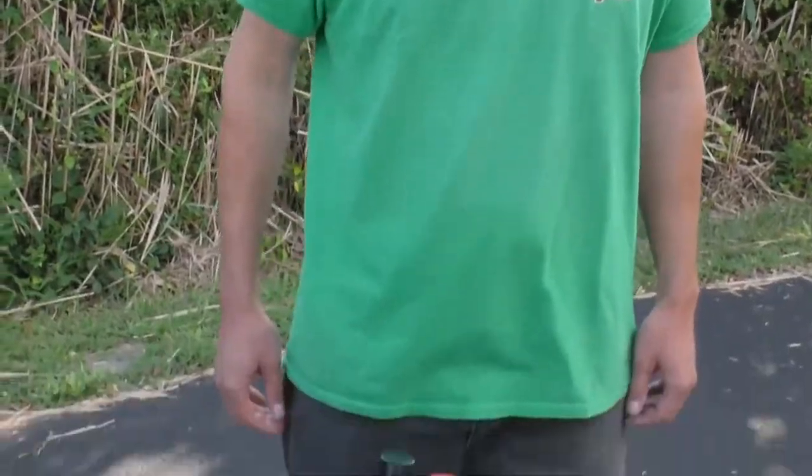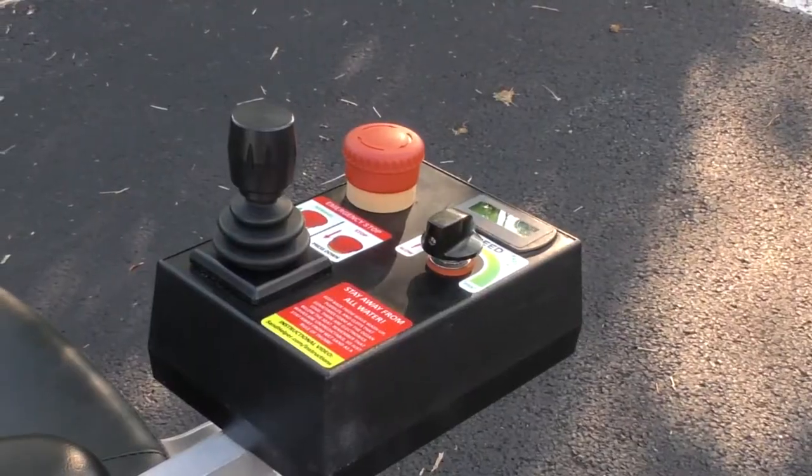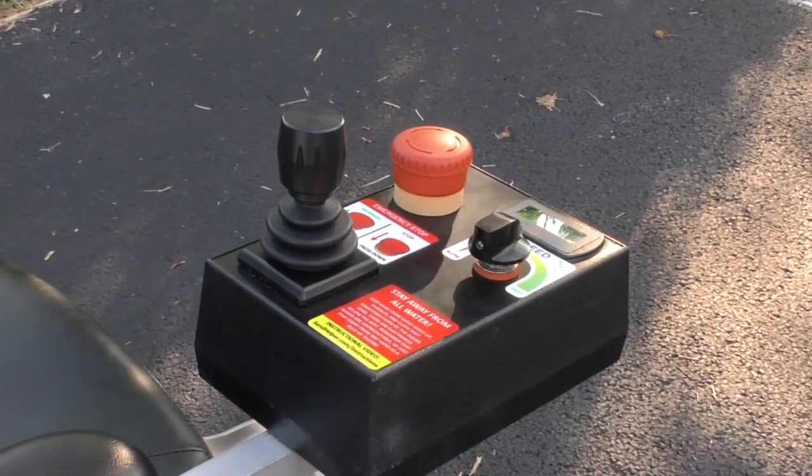There is a battery meter right near the joystick on the controls box. The battery meter is accurate when the wheelchair is idling. If the battery meter is showing less than 20 percent when you are idling, it is time to move your power cable and the key to your backup battery.